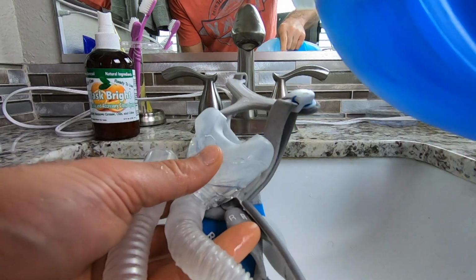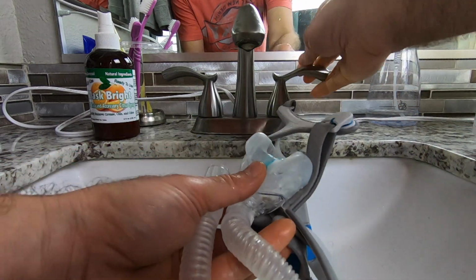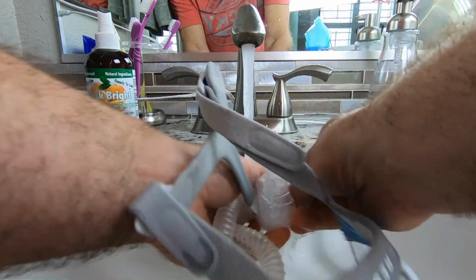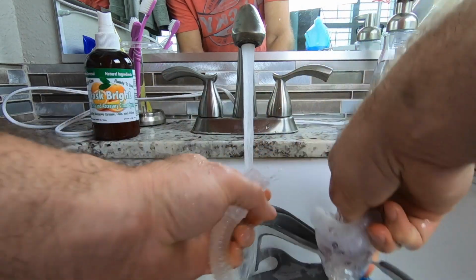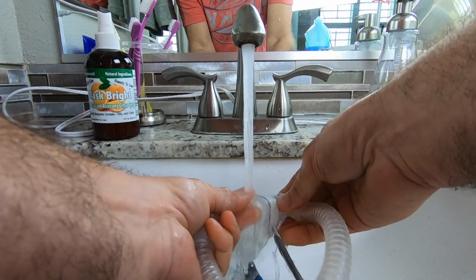Now, typically I would just put it in the hurricane dryer, but now I want to show you what I would do with Dawn dish soap. So with Dawn, I'm going to take a little bit and just drop it right on there. And now I'm going to have to get that kind of wet and sudsy. And you saw I had to work it around quite a bit.